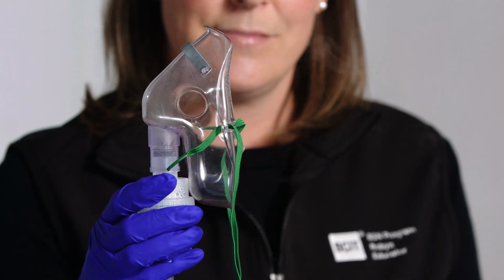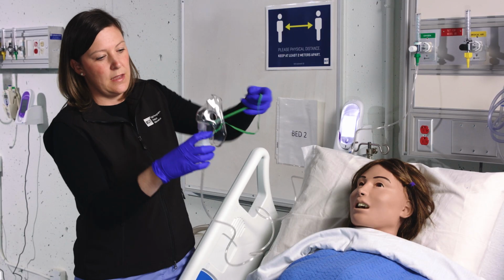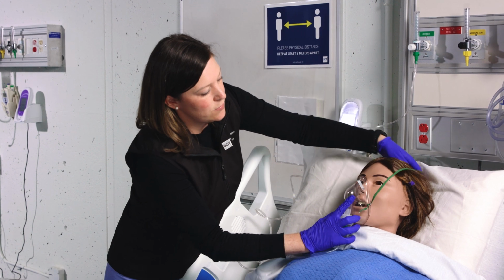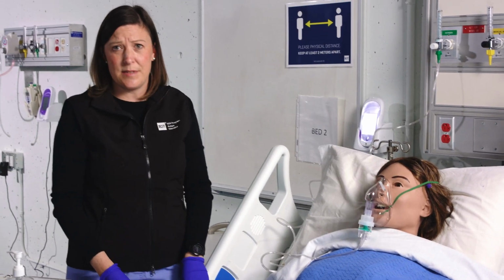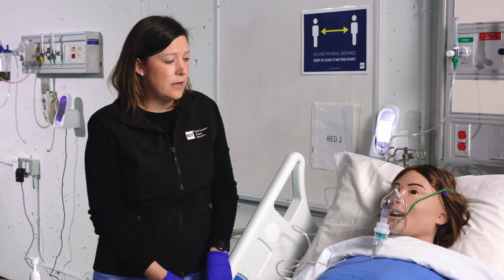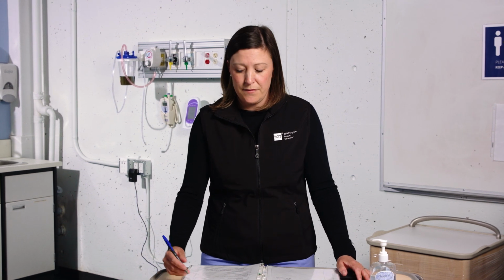I'm going to make sure that this medication is staying in the bottom here. And so I'm having Mrs. Jones sit up nice and tall. I'm going to have her take some nice, slow, deep breaths if possible. And this is going to last about 5 to 7 minutes. I have just completed the skill of administering a medication by nebulizer, and I'm ready to sign off on the MAR.